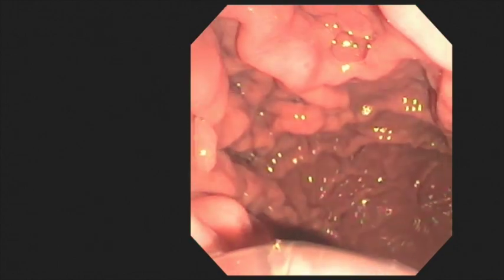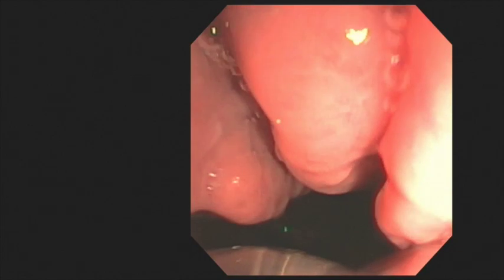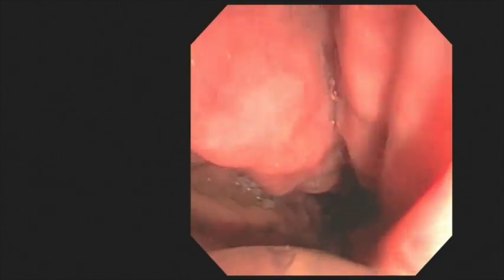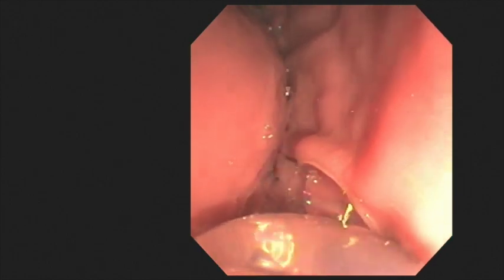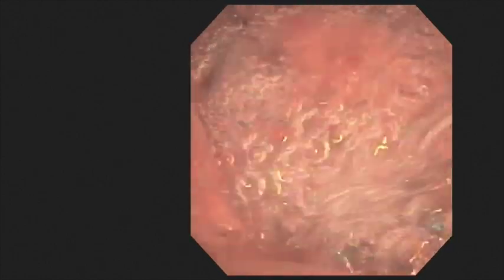The endoscopic evaluation confirmed thickened gastric rugal folds in the proximal stomach with a normal stomach distally. No focal or submucosal masses or ulcers were seen. The mucosa was erythematous, and there were no features of portal hypertensive gastropathy.